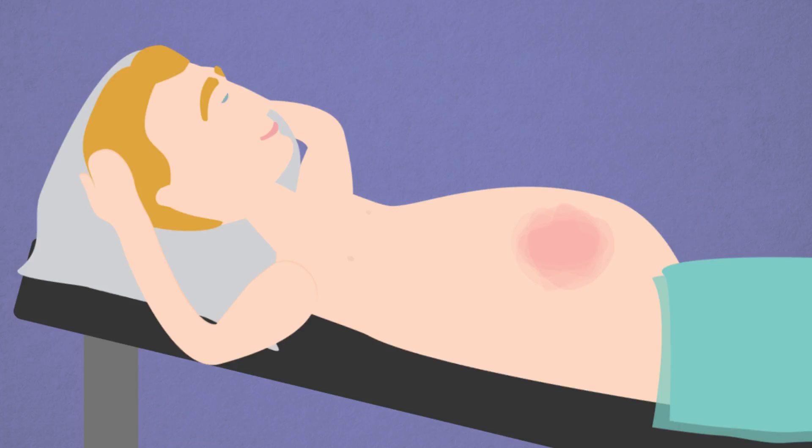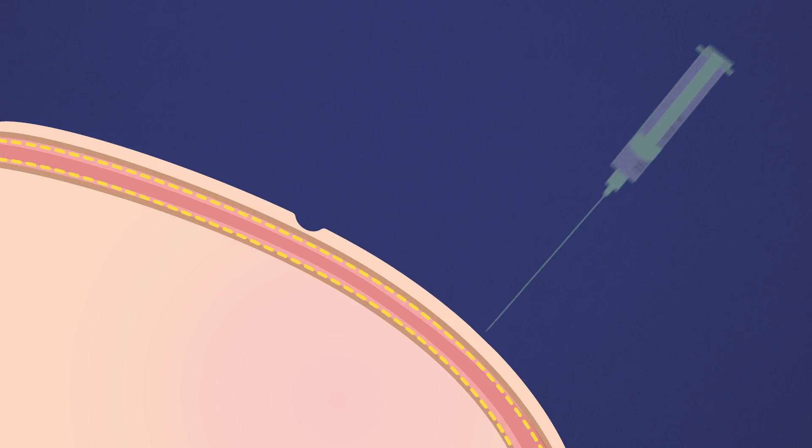After numbing, there is usually not a significant amount of pain with this procedure, though some pressure and discomfort may occur. After your skin is numb, a needle will gently be inserted in your abdomen until fluid can be drawn back. The fluid flows slowly through the needle.